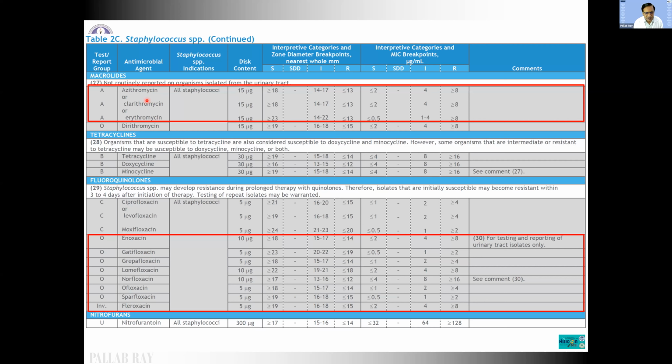There can be complex boxes also. For example, if you look here, it says ciprofloxacin or levofloxacin. These two have nearly identical behavior, whereas moxifloxacin, being within the box but not connected by OR, is very similar, but the susceptibility is not completely predictable.